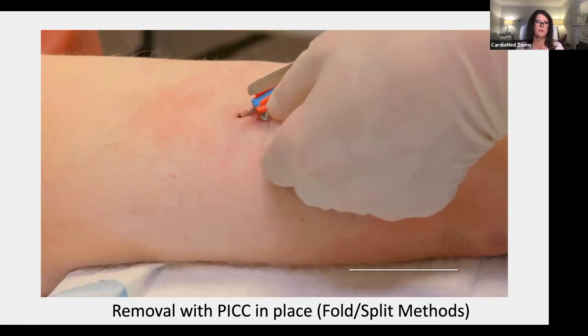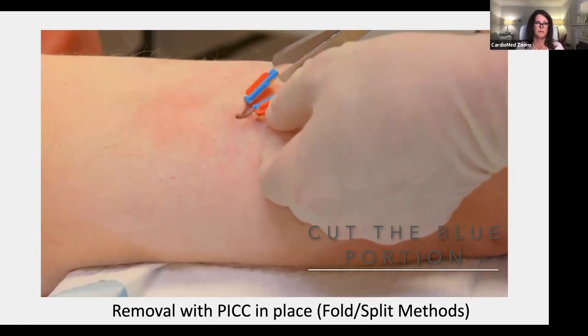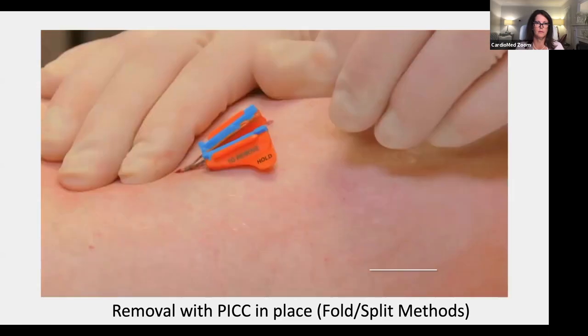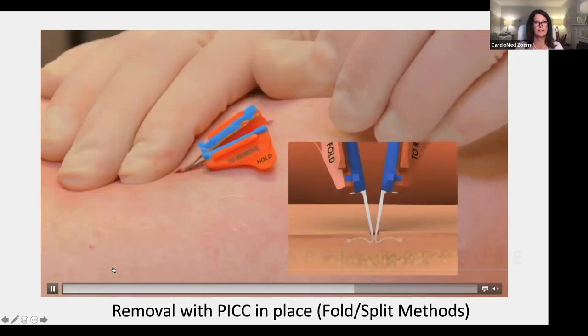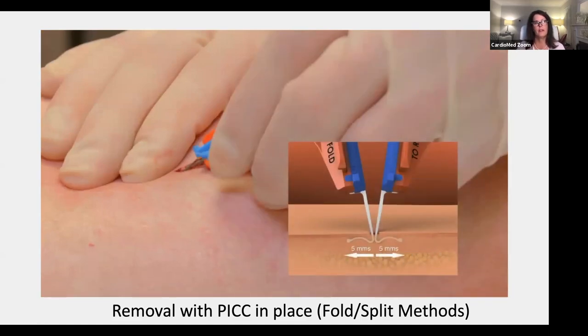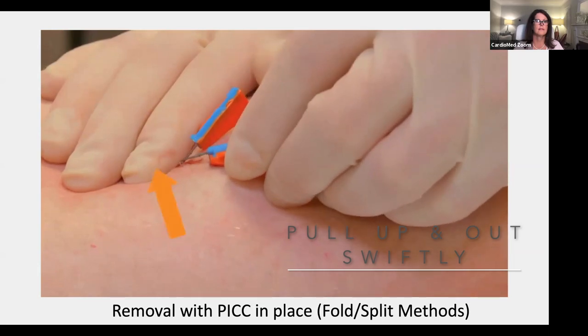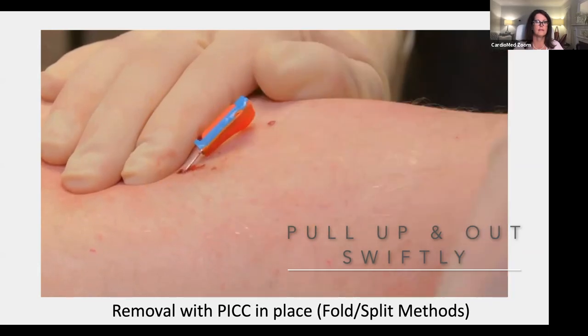Use a blunt tip scissor to cut the SecurAcath base completely in half lengthwise along the groove. Apply firm pressure with one hand right at the insertion site. The flexible securement feet are shaped like an L, extending 5 millimeters to each side of the insertion site. Grasp one half of the cut SecurAcath base, keep it horizontal to the skin surface, turn the cut blue edge upward and use a swift, deliberate upward motion to remove each foot separately, following the shape of the foot.